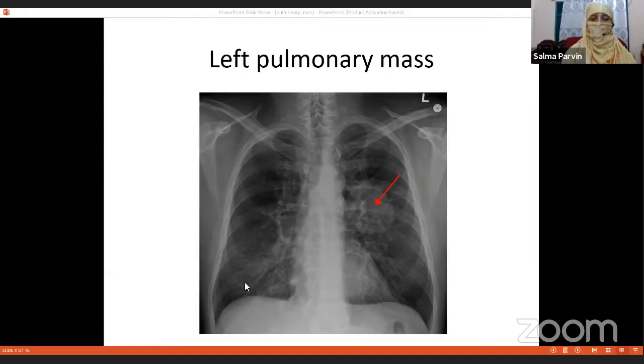And this patient has got a mediastinal shifting, at least some part is there. So there is a malignant lesion here, and there is a mediastinal shifting here. Probably the left hilar lymphadenopathy is also similar. Maybe hilar. It is really a suprahilar location here. This opacity is from the lymphatic extension probably. The diaphragm on both sides is retaining its normal position.